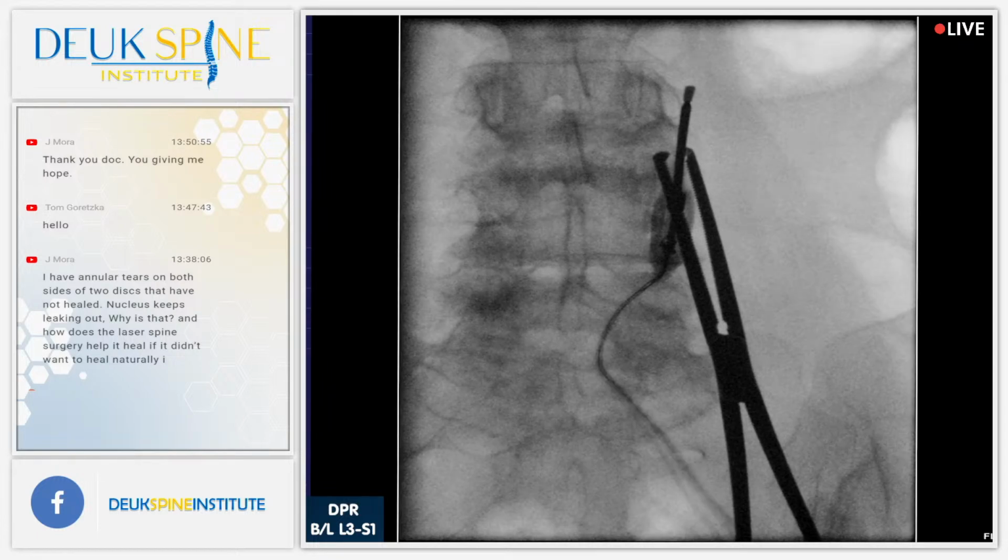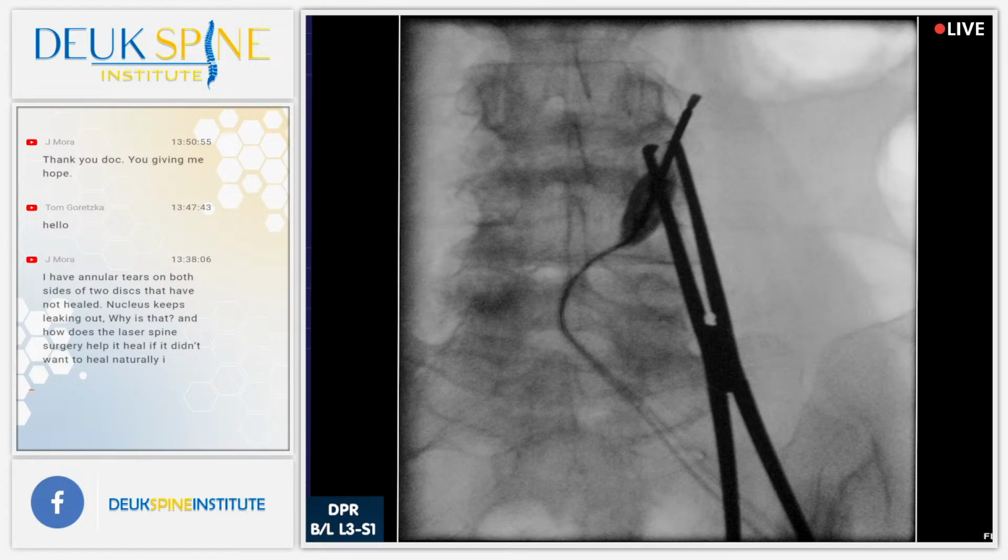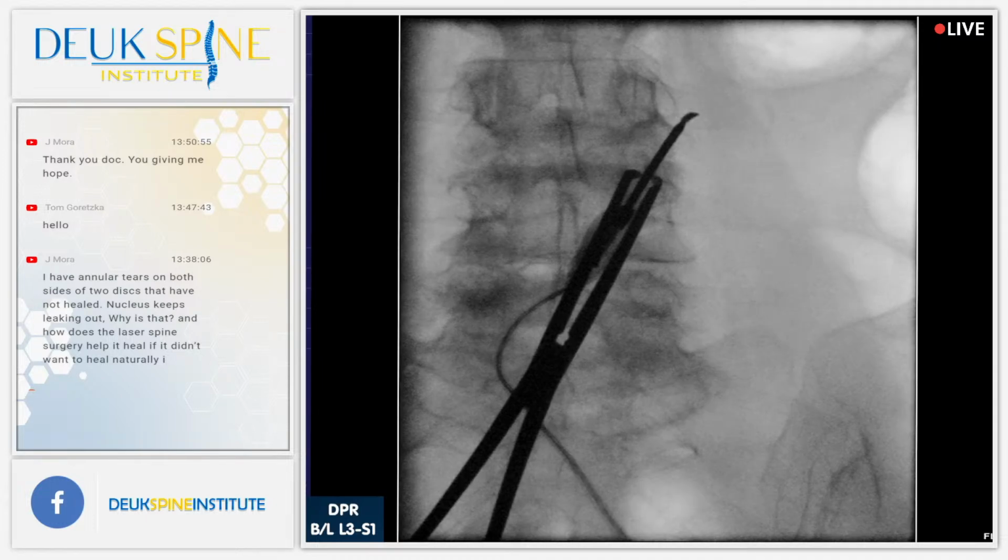Shot? Feels like it's too high. For those of you who don't know, this area we're working on is really difficult because there's something called the mammillary process, which is what I'm on right now. It's quite literally a bump that pushes you. It's like the top of a roof. It either pushes you up or down, but it doesn't let you stay right where you're supposed to be. So it's hard to be in the right spot because the mammillary process forces you up or down, and you don't want to go up, you don't want to go down. I mean, you want to do a little bit, but not a lot. All right, that's good.